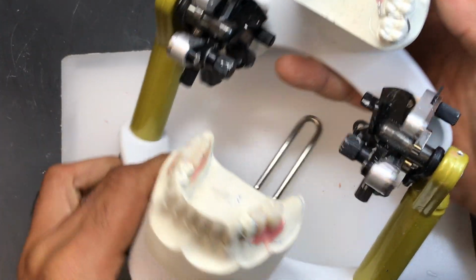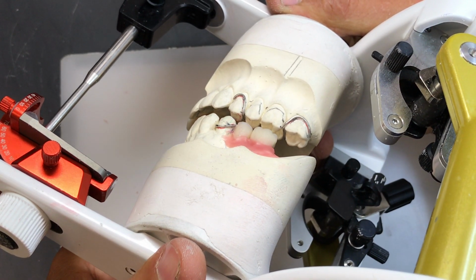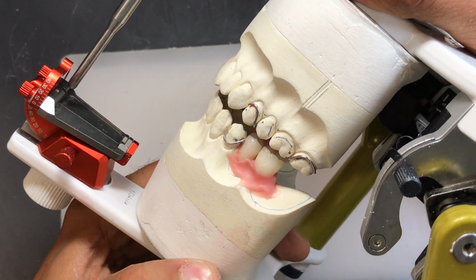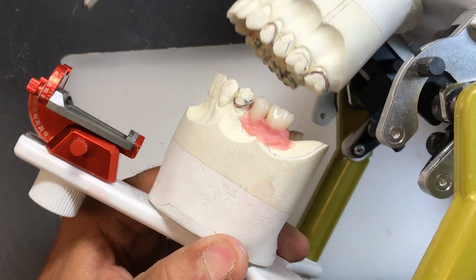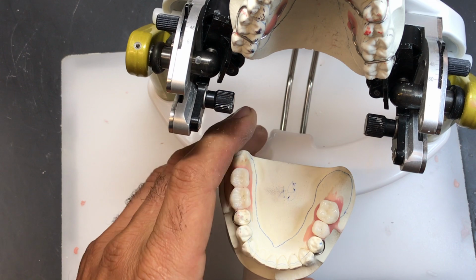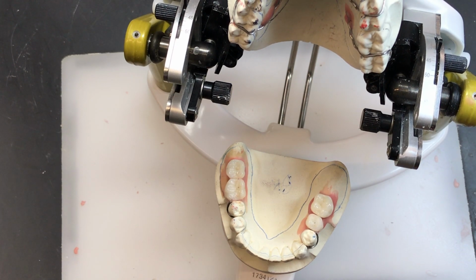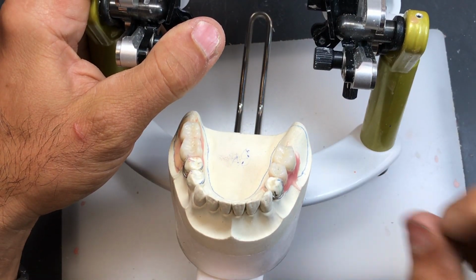And see how that tooth now relates to the opposing as we bring it together. That looks pretty good. I got lucky with that one in terms of the vertical position. And again, this one, I'm about 1 millimeter open versus 1/4 millimeter with the 4-5. But if you recall, when we're doing selective grinding, because of the angle, the further back you go, the more you can compensate. So therefore that millimeter opening right now on the 6 versus the 1/4 millimeter opening on the 5 is going to close a whole lot quicker when I start grinding it in.